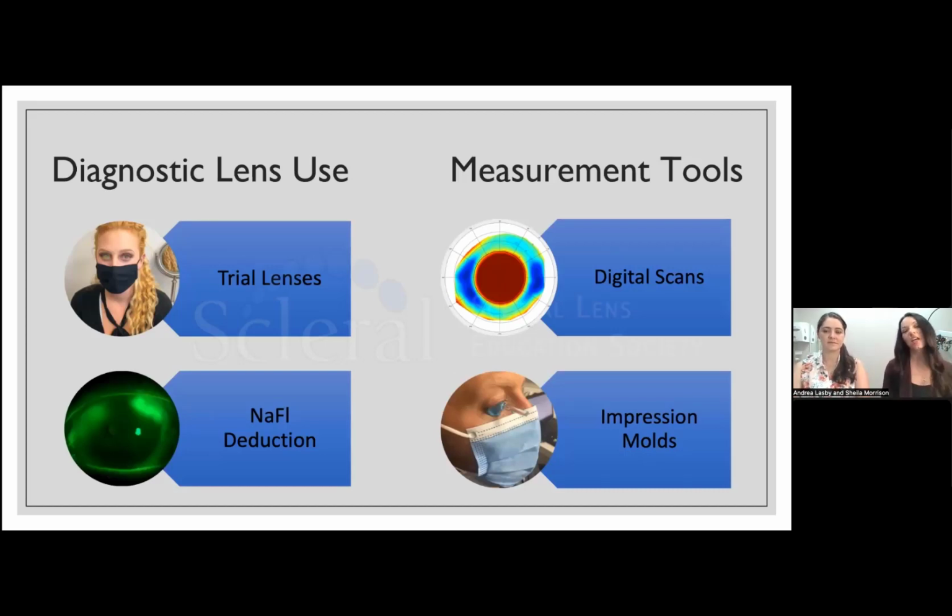How does it land? And that's absolutely part of our practice with almost every single fit. Now we can also do it the other way, which is, they merge together, but measuring first is the other method. And that's the way that we have kind of alluded to when it comes to the freeform digital scans, using technology to really get a good comprehensive view. So learning about the eye shape by deducing the shape, or learning about it by measuring first, both are accurate ways that can get to the final answer.